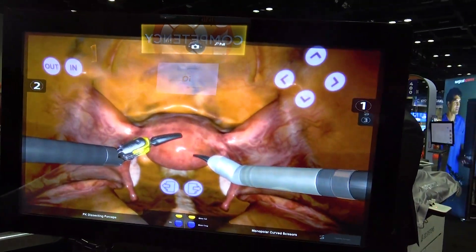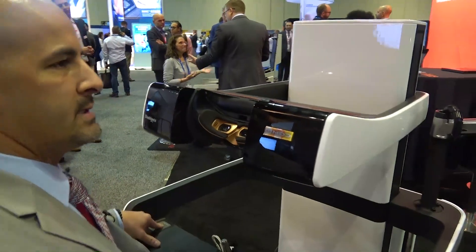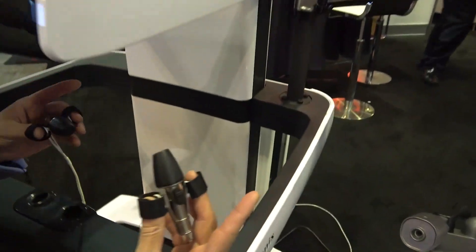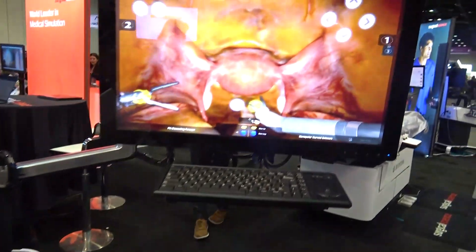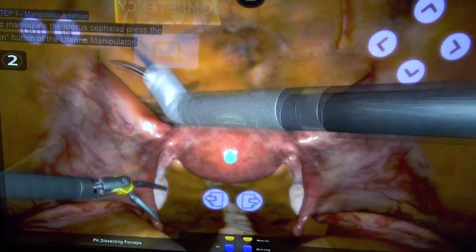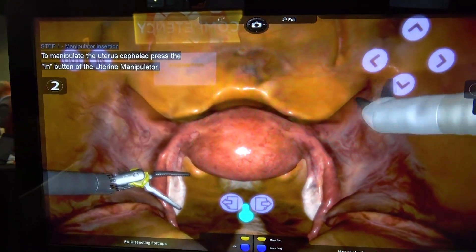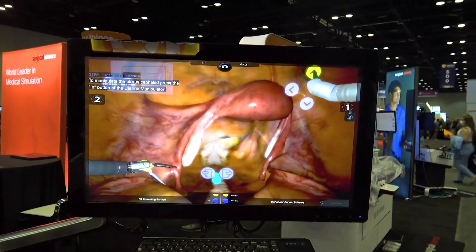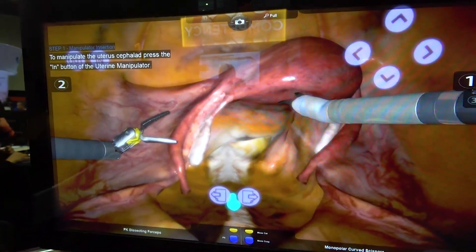Just like in real life, the doctor can put his head inside the head mount, grab the controls, and do the procedure one step at a time. You can operate everything virtually, and this allows doctors to complete a full procedure step by step in the Robotics Mentor environment.